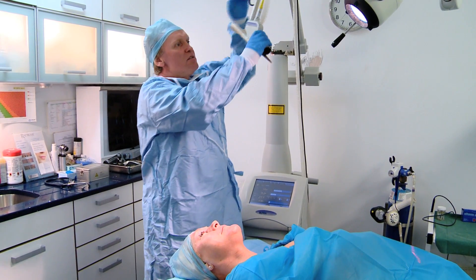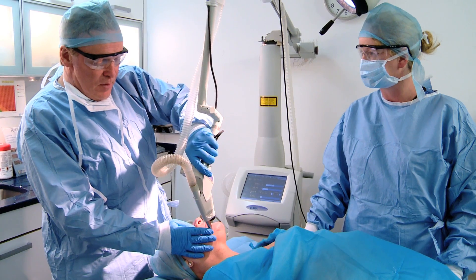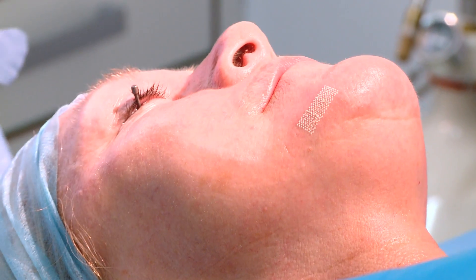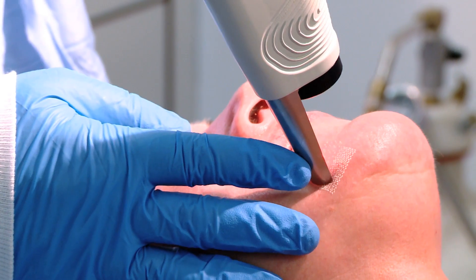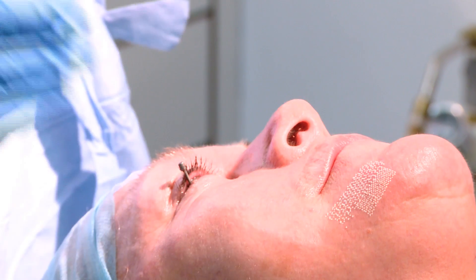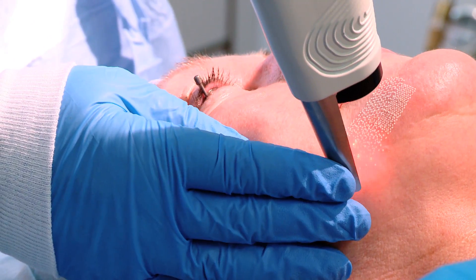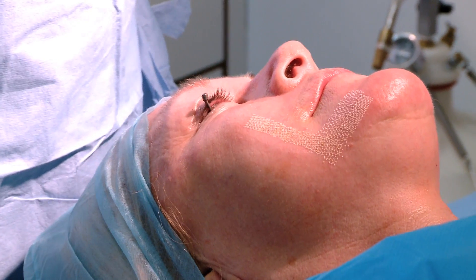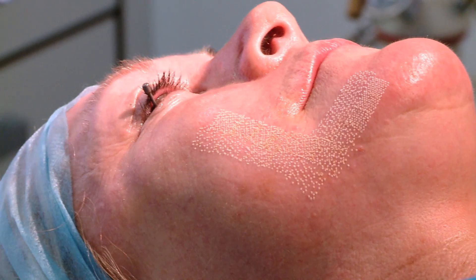Probably the best thing to do first is ensure everybody is protected with laser eyewear. The easiest place to start will be in the area covered by the regional nerve blocks. At size 6, if we do it at size 8 we can see the type of effect we get, but the Active FX won't let me go much bigger than that. Running it on density 3, we can see the difference — density 3 looks like a good setting.